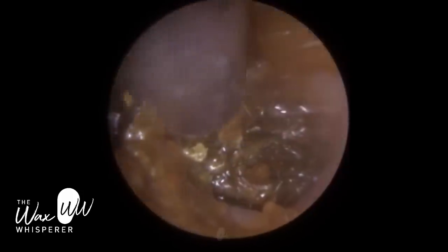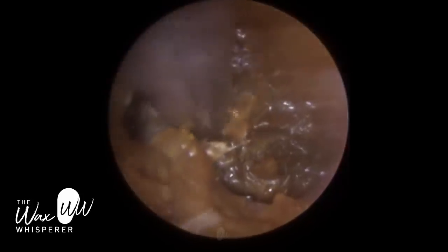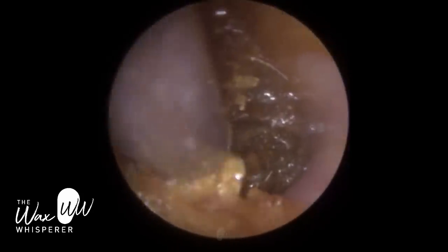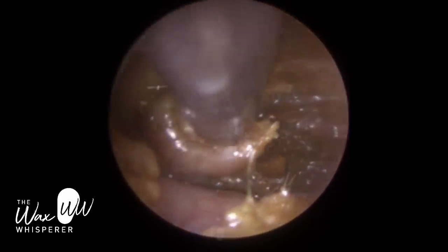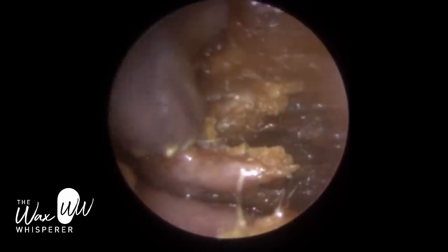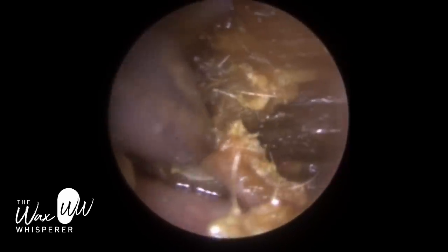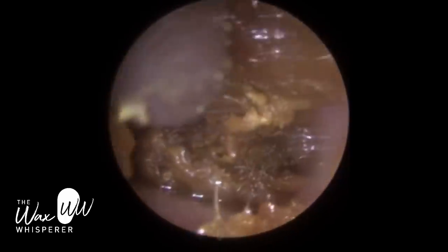They weren't sure, because one specialist in the past said she had a perforation and the other said she didn't. If there was any risk or possibility she had a perforation, she shouldn't have had ear irrigation — that's one of the contraindications. If you've got a tympanic perforation, you shouldn't be performing irrigation. I wasn't sure whether the patient had one or not. On the left side, I was trying to avoid using drops because if you've got a tympanic perforation, you want to avoid putting any drops in the ear, as that can enter the middle ear — the space behind the eardrum — and cause an infection, which you want to avoid.